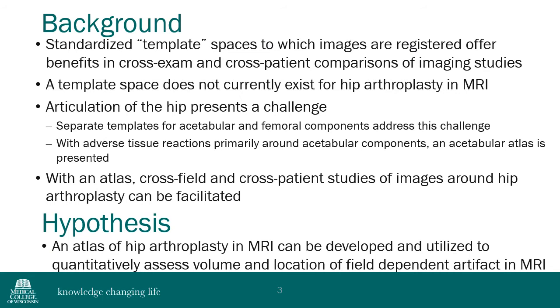Template spaces provide great utility for research in brain, prostate, hip, and other imaging research by enabling consistent cross-exam, cross-field, and cross-patient comparisons. Unfortunately, such a template does not exist for MRI of hip arthroplasty.